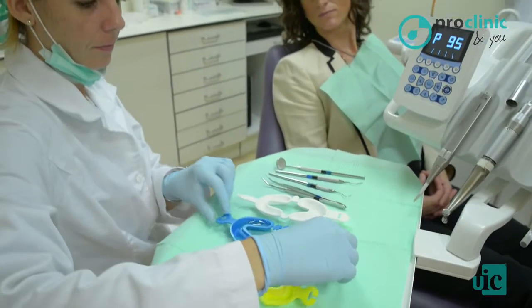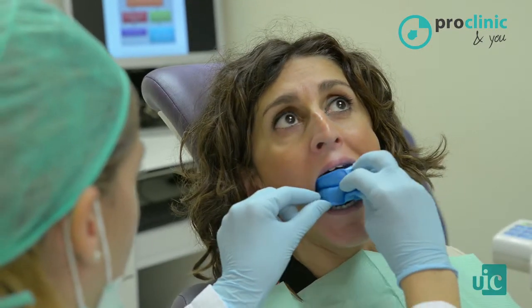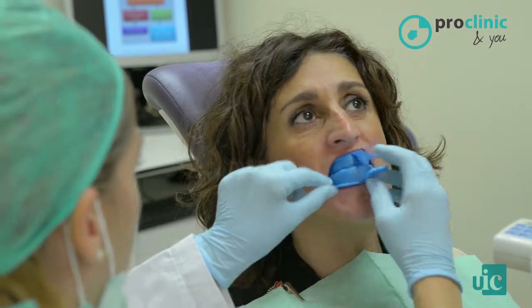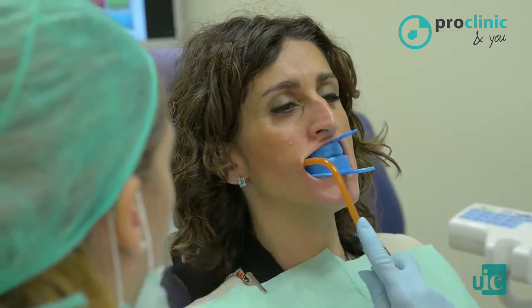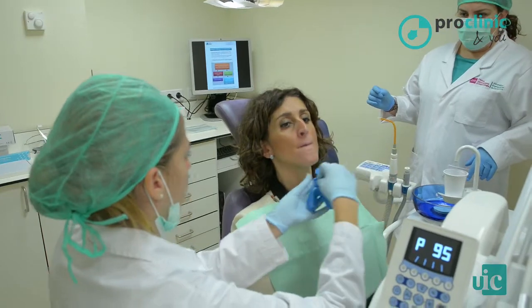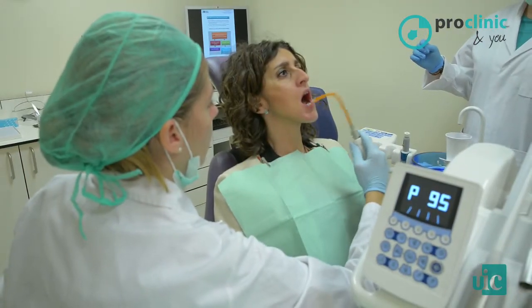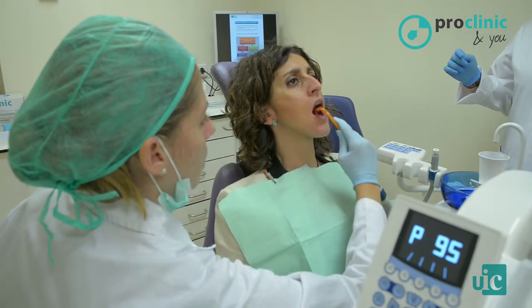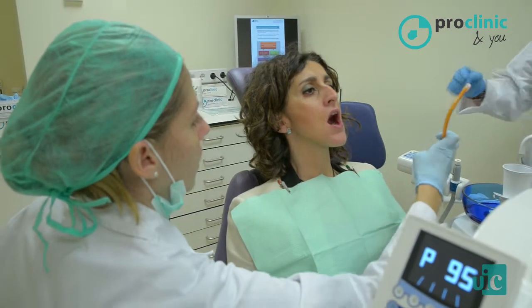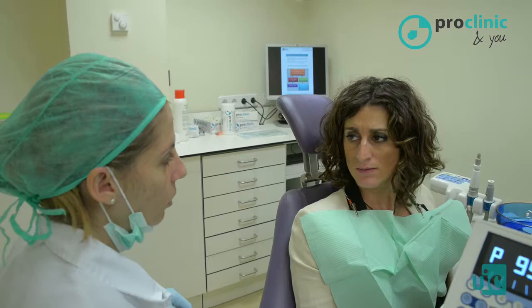Now you have to open your mouth. We introduce the tray. Bite. If you have a remainder of fluoride, do not swallow. Once we remove the tray, it is important to remove all excess with an ejector. Now you cannot rinse. You must be at least 1 hour without eating or drinking anything to allow the effect of the topical fluoride.